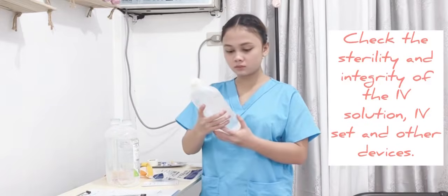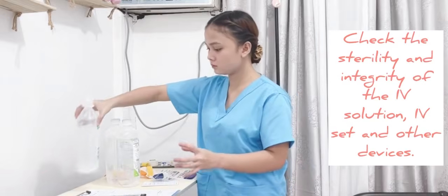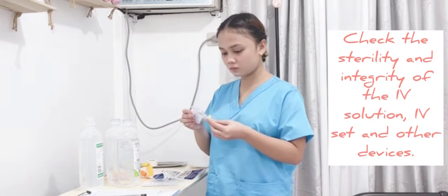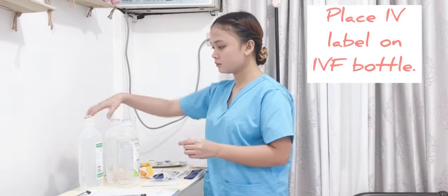Check the sterility and integrity of the IV solution, IV set, and other devices. Solutions that are discolored, contain particles, or are expired are not to be used. Leaky bags present an opportunity for infection.